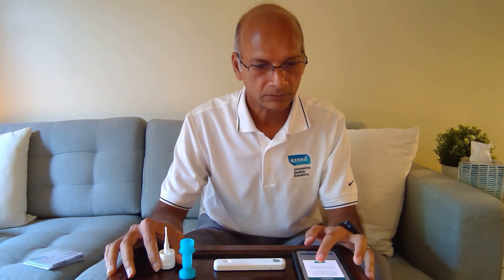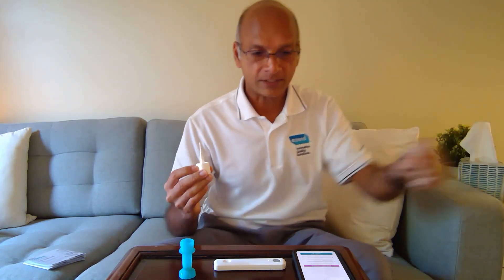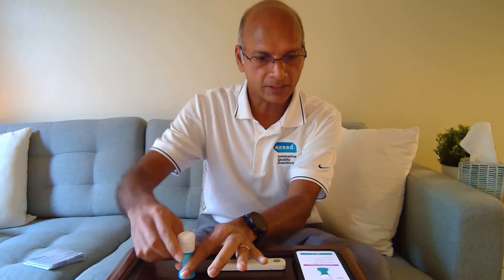Insert the swab. We have to take it up the nostril until it hits the tip, because then it will be the right distance, and we'll have to rotate three times. You have to do it quickly — and we did it in both nostrils. Remember, you have to do it in both nostrils. Keep a tissue box handy. Now the next step is to immediately screw the top on. This is a very good feature because nothing is dropping anywhere. Screw it as tightly as possible — force is required to create a proper seal, otherwise you don't want it to leak out.